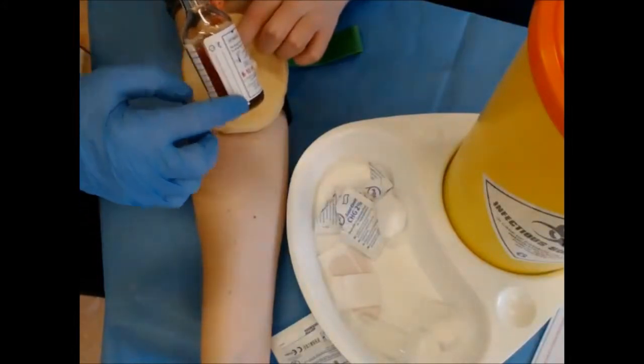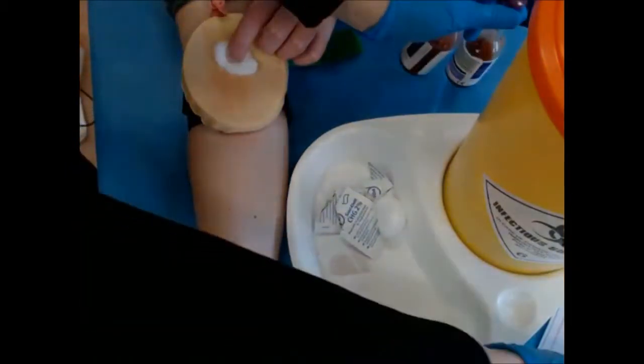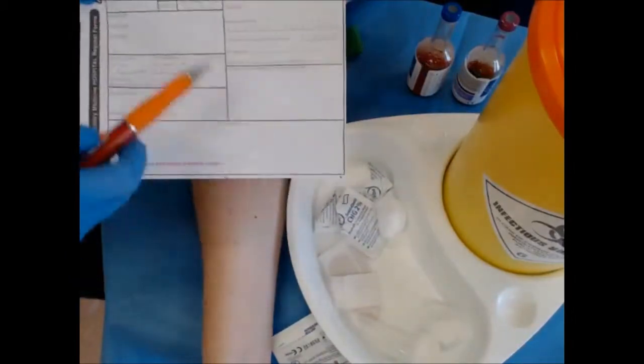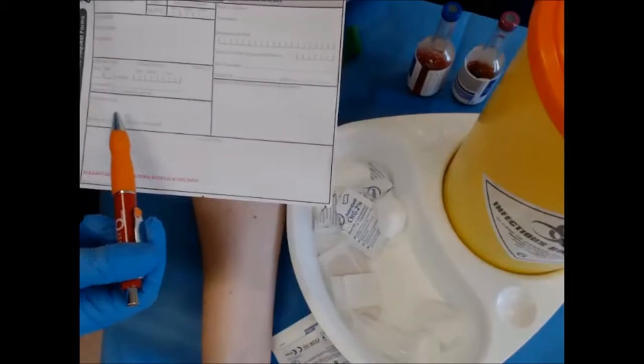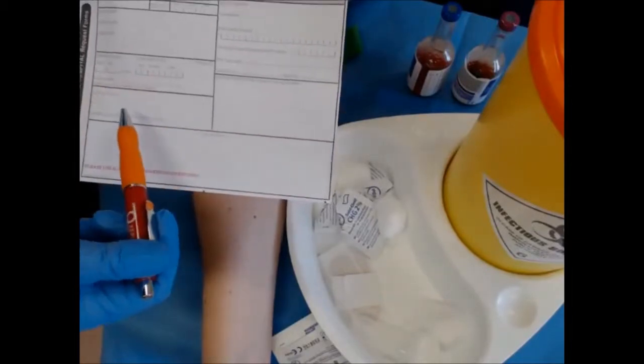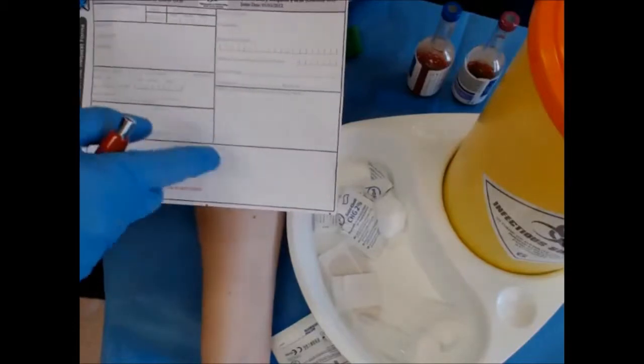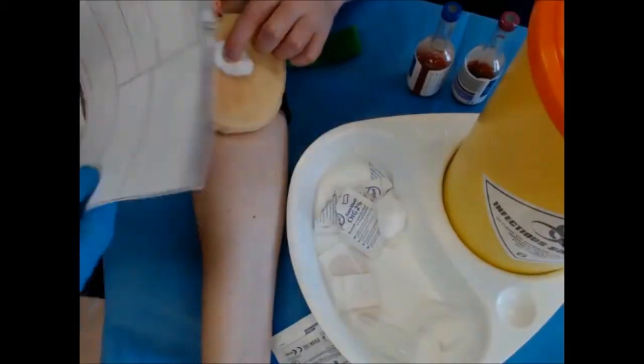Again, complete both bottles in pen or place an addressograph on the bottle. Then complete the patient's details on the lab request form. If they are on an antibiotic, document the antibiotic that they're on and what their temperature is and query what the source of sepsis is. Place the bottles in the bag and send to the lab.